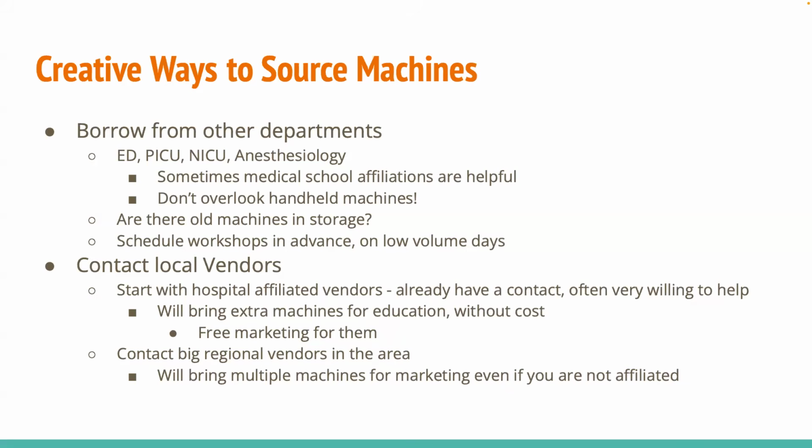So by bringing machines and doing education days, your radiology department or any other department that may already have point of care machines may have, with their contract, education days that can be added at no extra cost or that come along with it. So it never hurts to ask them, and contact your regional vendor and then ask other regional vendors in the area as well. Of those big names, like Sonosite or GE, and I'm not affiliated with any of these guys, there's a big market competition in my area.